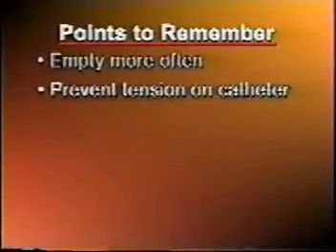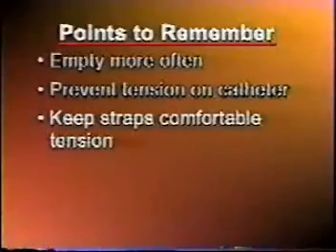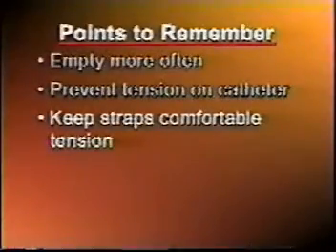I would like you to remember some points when applying the leg bag. It must be emptied more often because it is smaller than the drainage bag. Tension on the catheter tubing must be prevented. Care must be taken that the straps are not too tight around the leg.